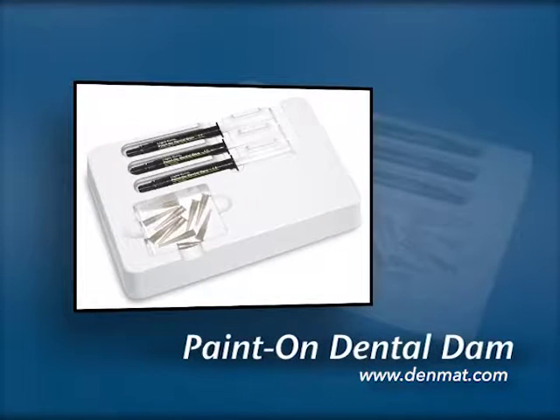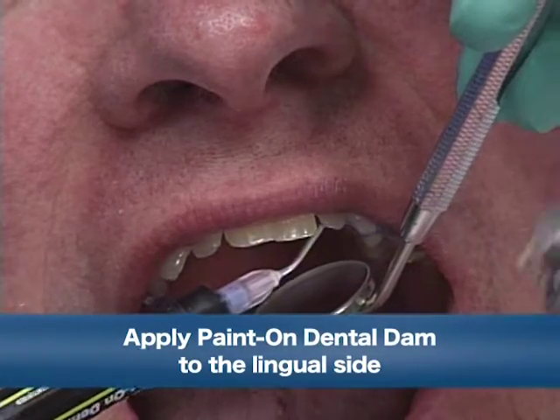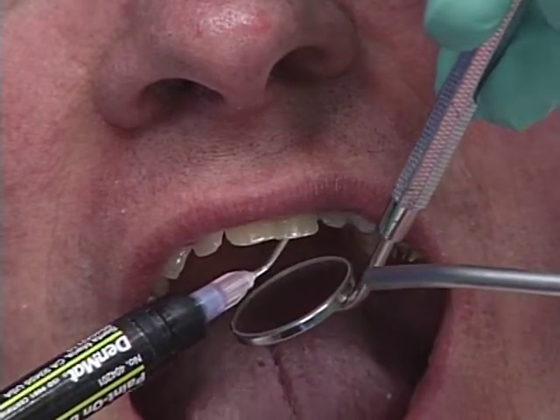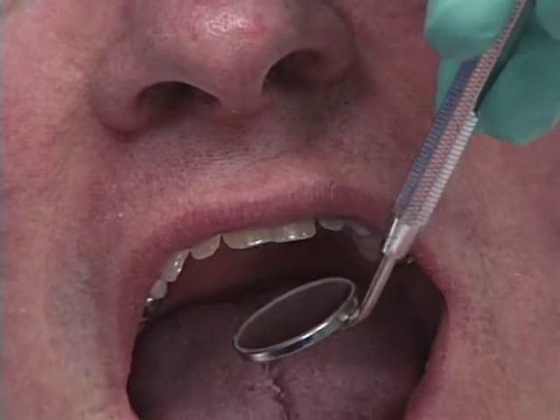First thing we're going to do is put some paint-on Dental Dam on the lingual surface of his teeth. We're going to prevent the Ultrabond and the Tenure from bonding to the lingual side, and the purpose of that is to facilitate clean-up.